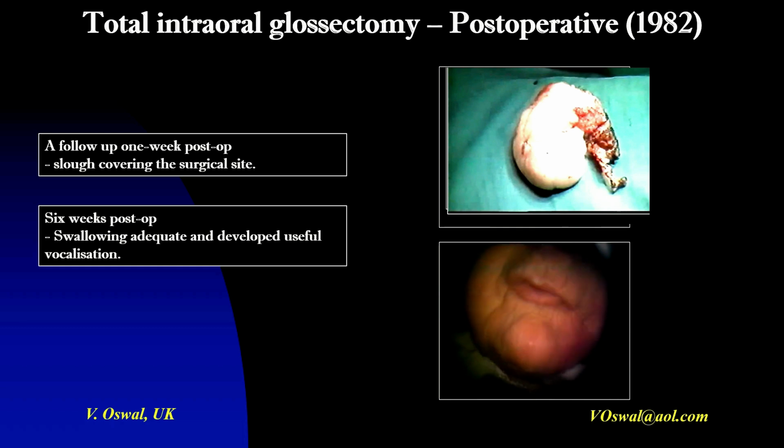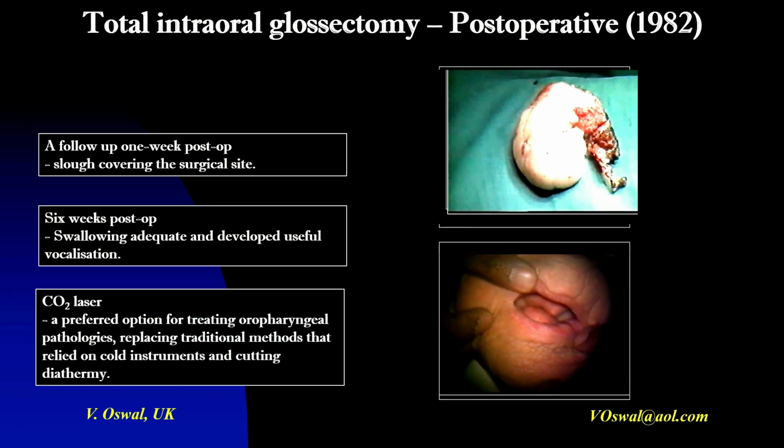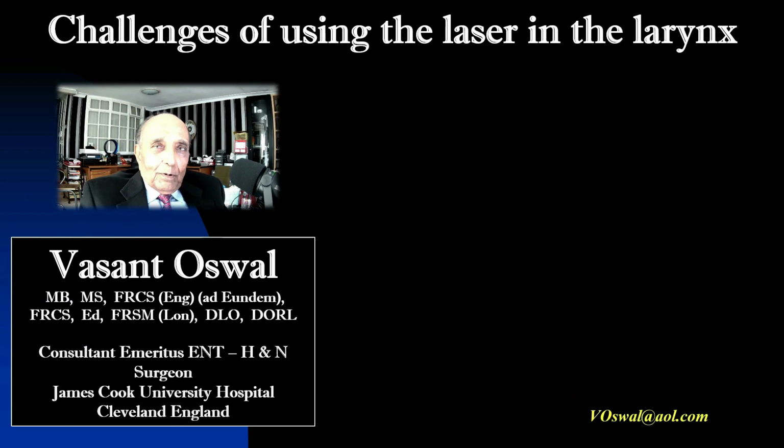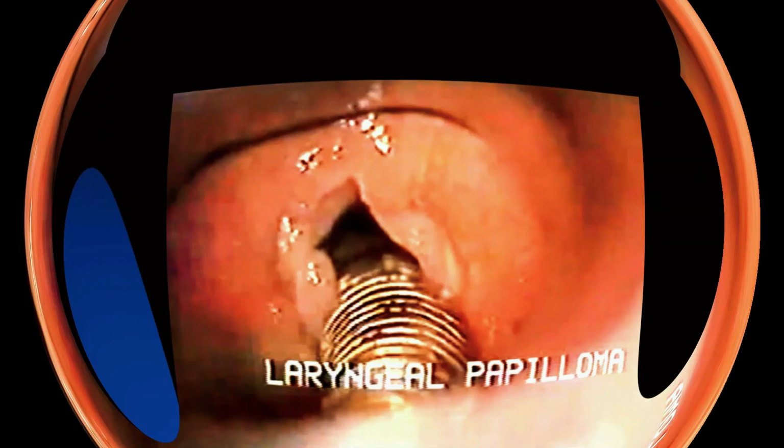Our CO2 laser experience showed unequivocally that laser surgery is a preferred option for treating oropharyngeal pathologies, replacing traditional methods that relied on cold instrumentation and cutting diathermy. Having operated on several patients with oral pathology, I started using the laser almost as a standard surgical tool. The time had come now to think about using the laser in the larynx.